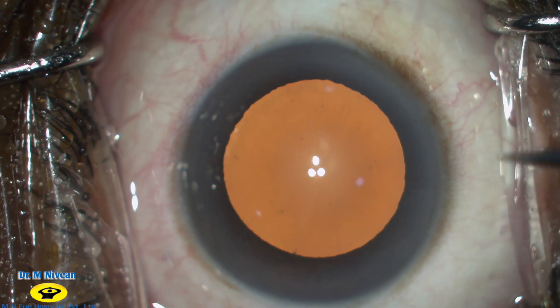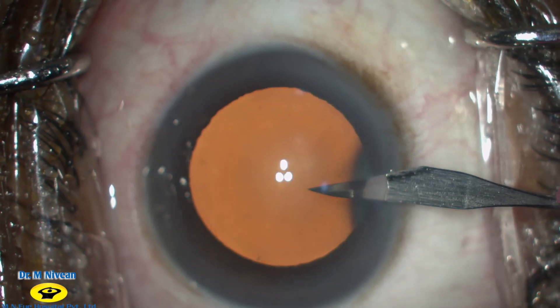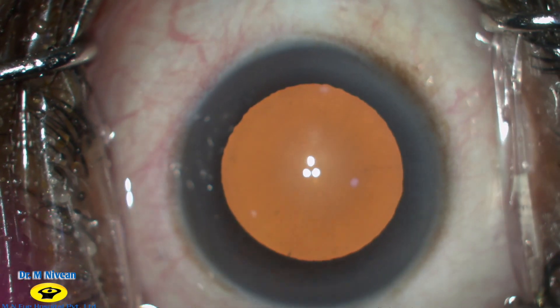This is a case of a Grade II Nucleus Sclerosis which was planned for a clear corneal phacoemulsification with the new Acriver Trifocal IOL.